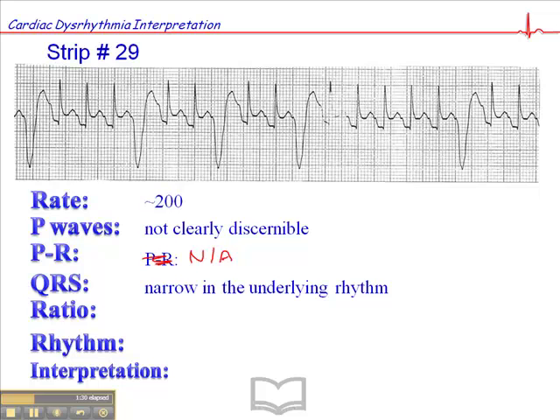The QRS is narrow in the underlying rhythm, but we do have these wide complex beats that happen earlier than expected without associated P-waves, and so those are premature ventricular complexes. The ratio is not applicable, and the rhythm is irregular only because we have this regular tachycardic rhythm disrupted by these premature ventricular complexes.